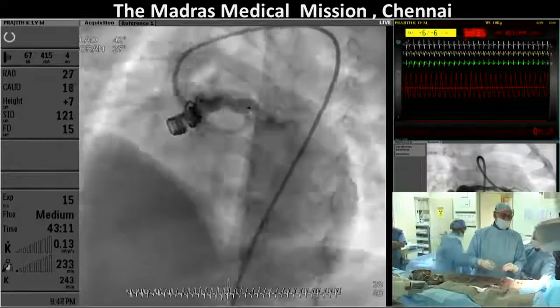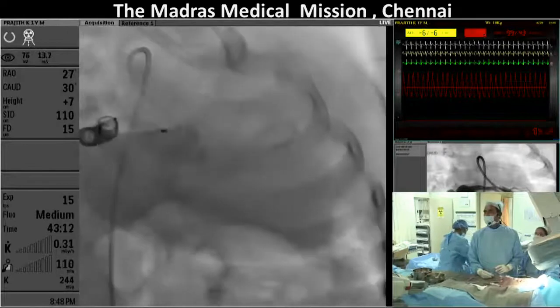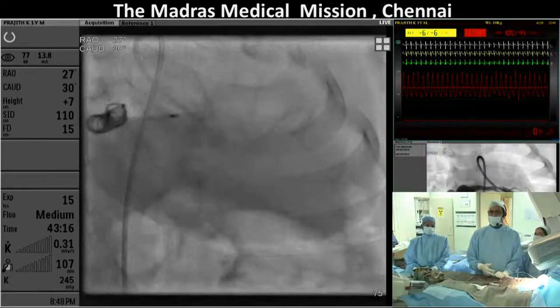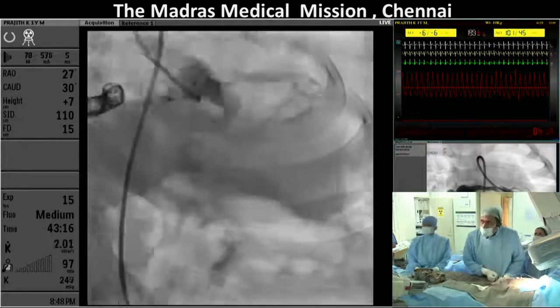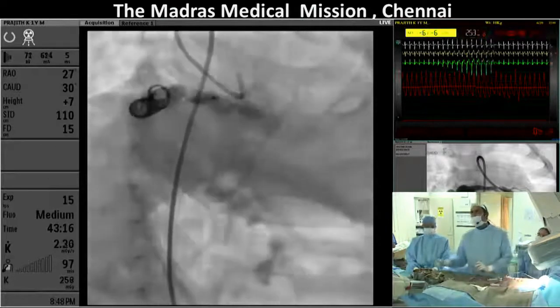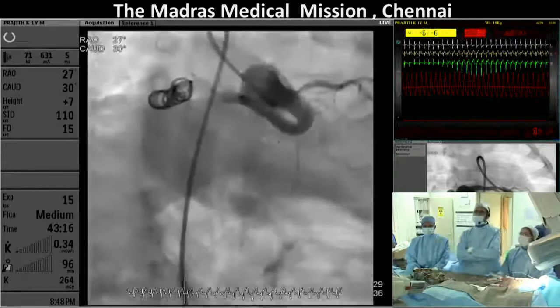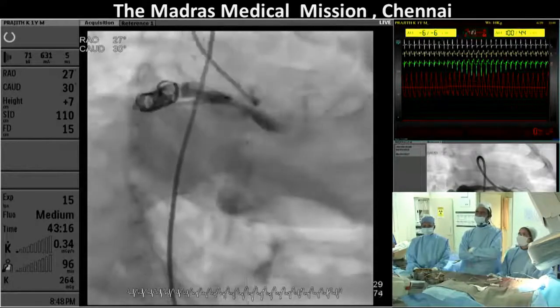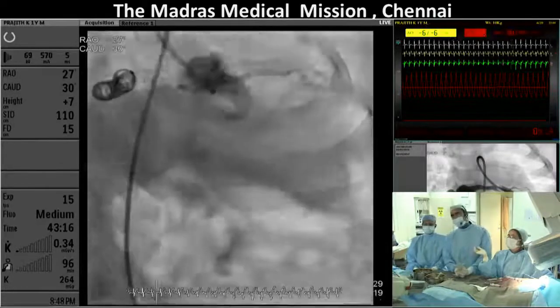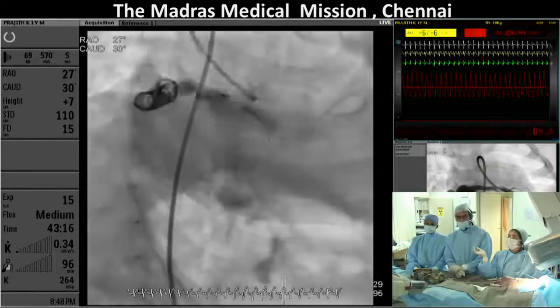But for this transmission, I won't be doing so many angiograms. Wait a second. What is that there? What is that there, late, on that angiogram, going towards the SVC? We'll have a look again in a minute. I don't see it. That's fine, Shiva. Yeah, flow there. I think there is a sinus nodal branch. There's a tiny little branch.